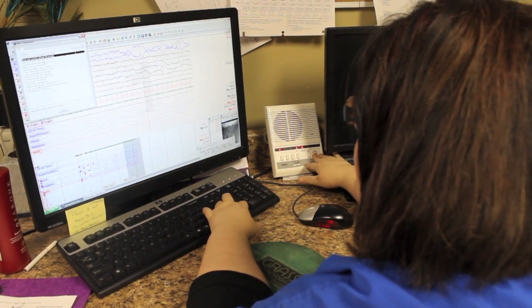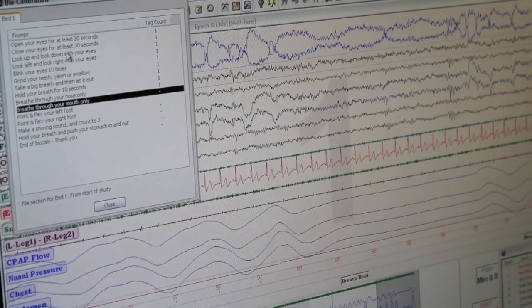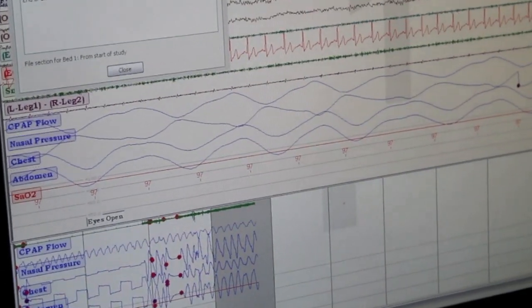I look at the EKG to see whether there are any heart rhythm abnormalities — I think that's important. Then after that I go and look at the breathing. When I'm checking their EEG to see what stage of sleep, we do that in an epoch that's 30 seconds in length. But when I go back and look at the respirations, I back off a little bit and look at it five minutes at a time. We get a better indication of breathing when you can condense it and see it a little bit better.